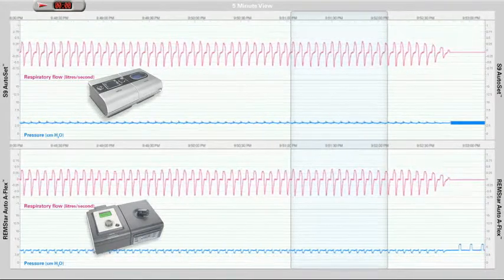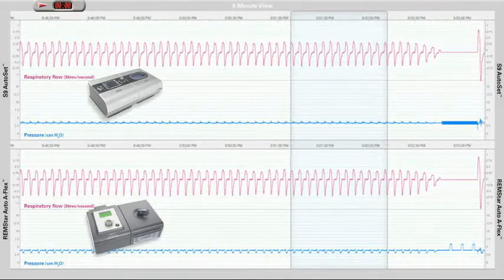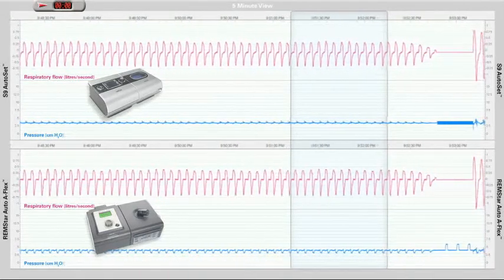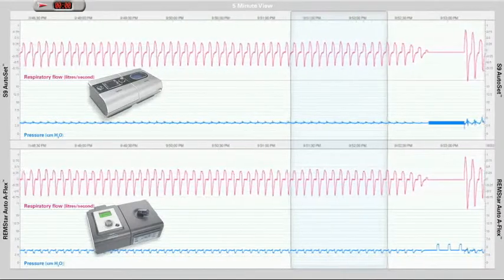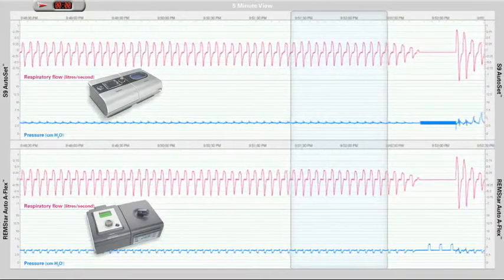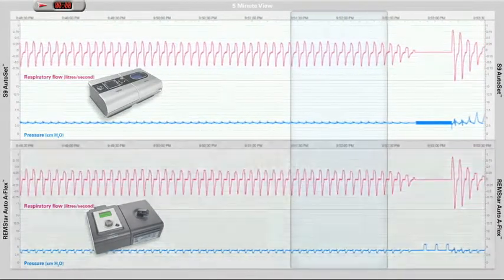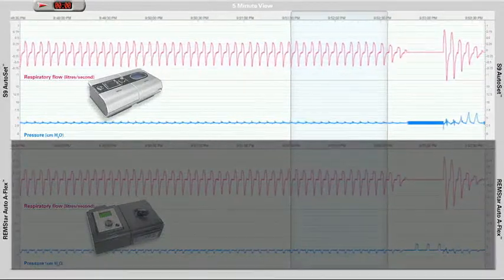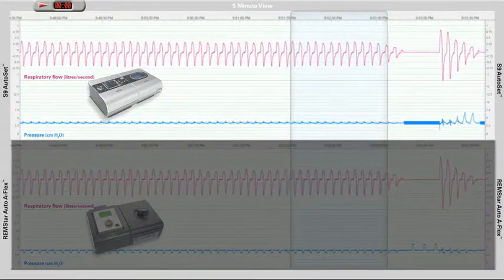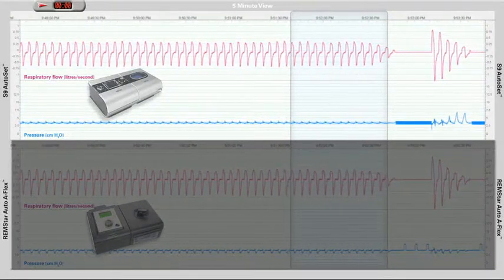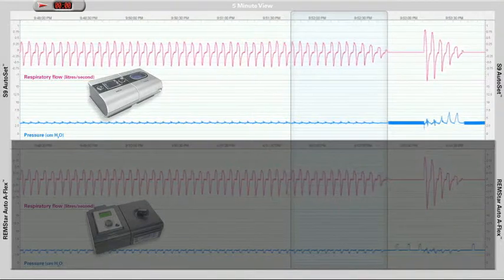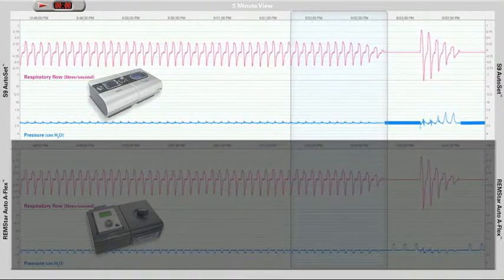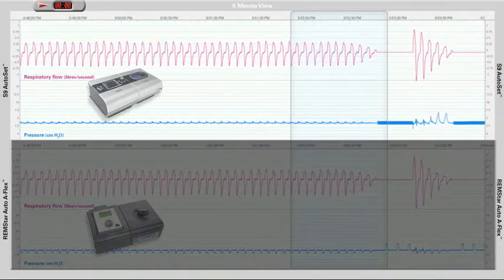The patient is considered effectively treated when the median pressure reaches approximately 8 centimeters of water. The first two traces show respiratory flow and the measured mask pressure from a patient using ResMed's Mirage Swift FX Nasal Pillow System and the S9 Autoset device.